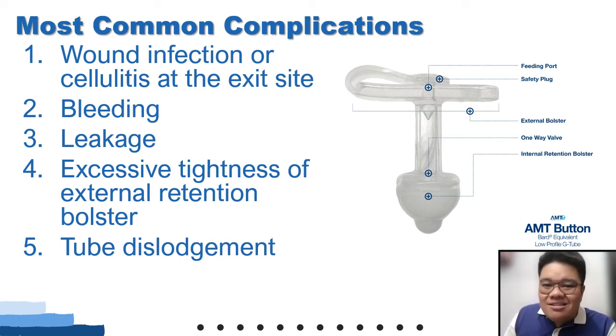Okay? Plus, this is how your gastrostomy tube would look like. This is the tube already under the skin of your patient, going towards the stomach of your patient. This is the part that we can see as nurses when we are feeding our patient. Okay, class, this is the safety plug that we remove whenever we will be feeding the patient. That's the safety plug that we will be removing whenever we are feeding the patient. Now, what do?